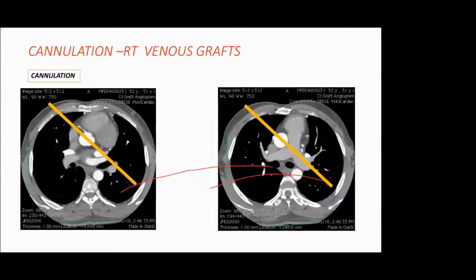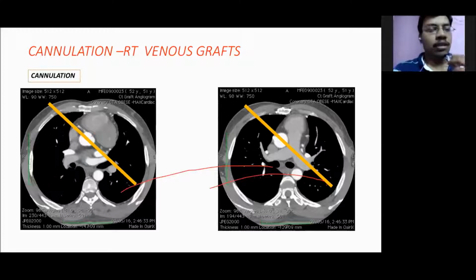And I experienced this in a patient with a left coronary injection. The LIMA was filling, the lower third was filling retrogradely, but inside the LIMA there was competitive flow. There was left main disease with an ostial LAD, some tight lesion was there, but the LIMA was patent with some competitive flow inside it. It was filling retrogradely. We could not engage the subclavian through the femoral.